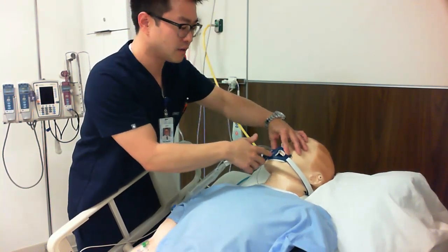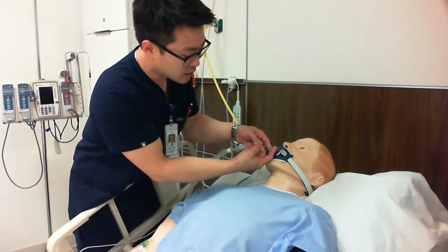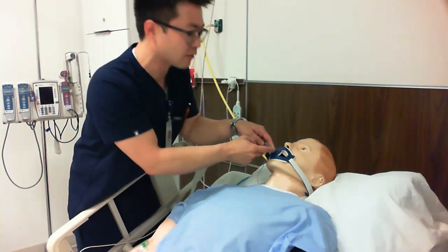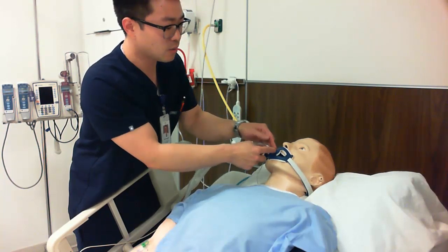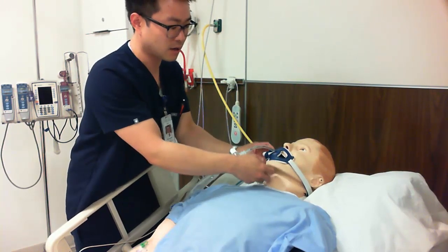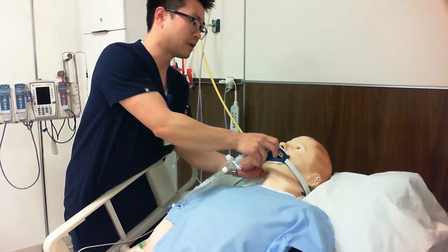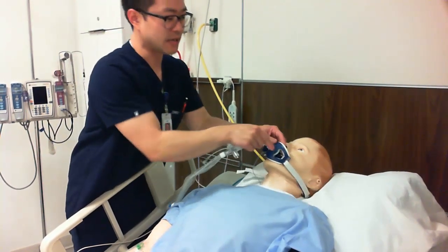So this anchoring device, you can see on the outside, this blue part, it's plastic. I can read a physical number right outside of here, and it's about 20 right now, right at that point where I have on this plastic piece. The reason I don't want to use this anchoring device for my measurement is because it could be moving around. And so what's happening on the inside is this tube is moving around. So let's say that my patient somehow wiggles free, and this device comes out.